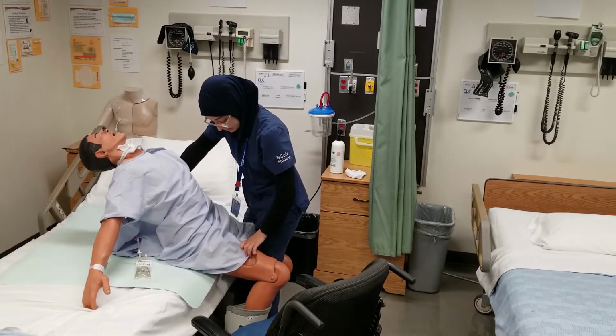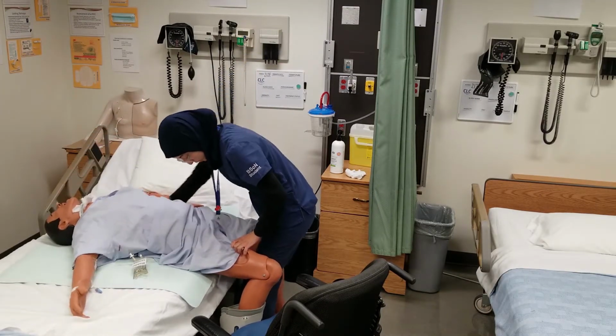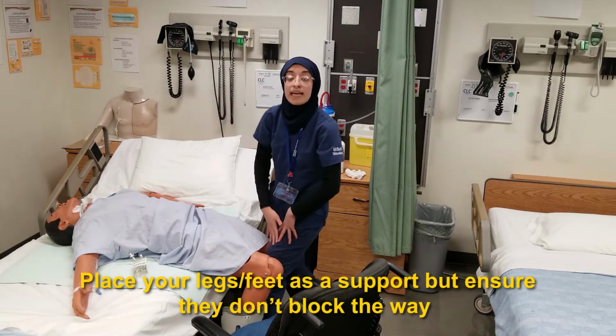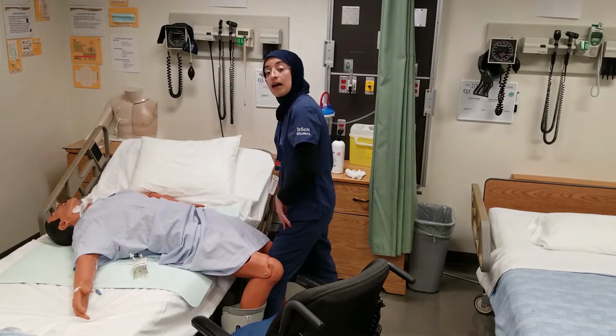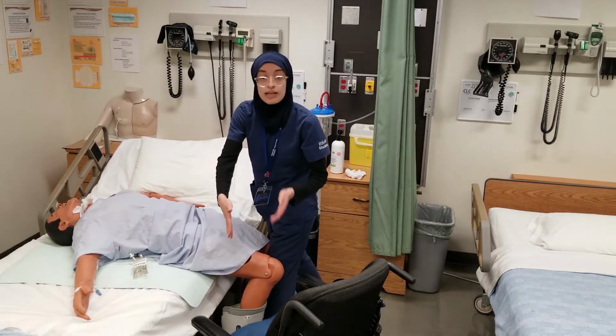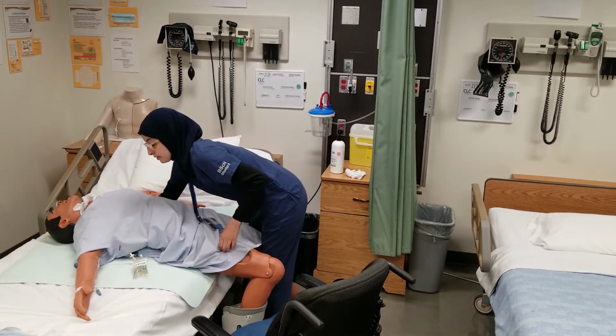I personally like to make sure that my legs are in between their legs, so if they do get up and they're wobbly or they try and fall, my leg is there as a support. I'm placing a foot behind me so that I'm able to pivot afterwards and place the patient directly into the wheelchair. All right.